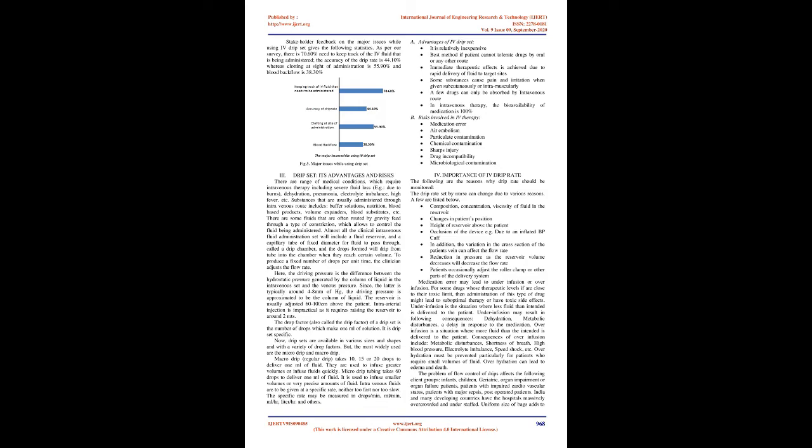There are a range of medical conditions, which require intravenous therapy, including severe fluid loss, e.g., due to burns, dehydration, pneumonia, electrolyte imbalance, high fever, etc. Substances that are usually administered through the intravenous route include buffer solutions, nutrition, blood-based products, volume expanders, blood substitutes, etc.